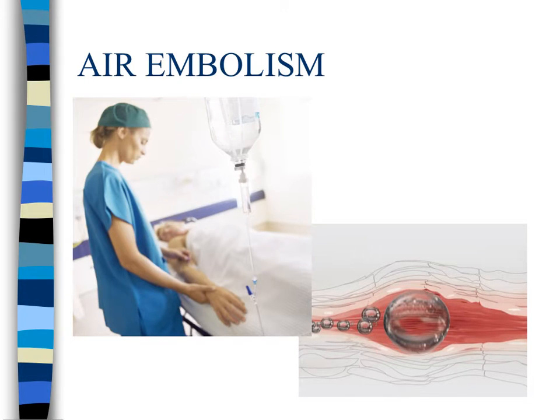Air embolism occurs most frequently with the use of central venous access devices. It occurs with the insertion of an IV catheter, during manipulation of the catheter or catheter site, when the device is removed, or when IV lines associated with the catheter are disconnected. Causes can include empty solution containers, where the solution container empties and the next container pushes air down the IV line, or tubing is disconnected from the venous access device or IV bag.